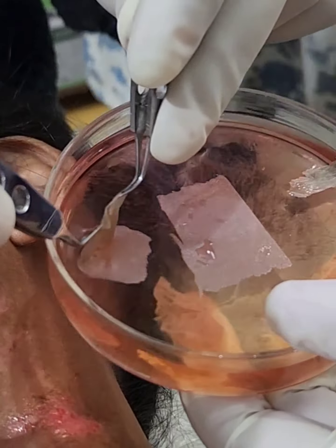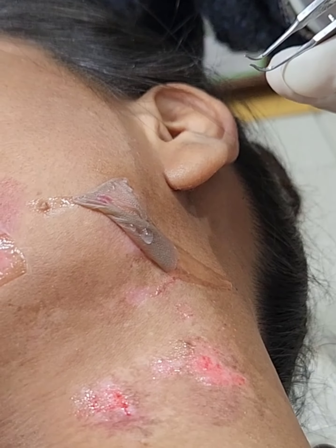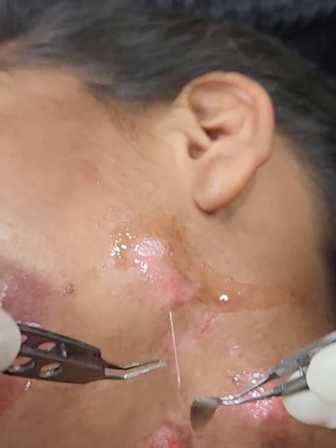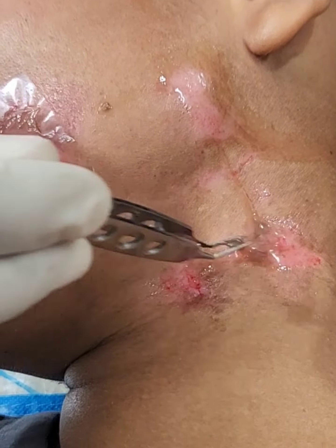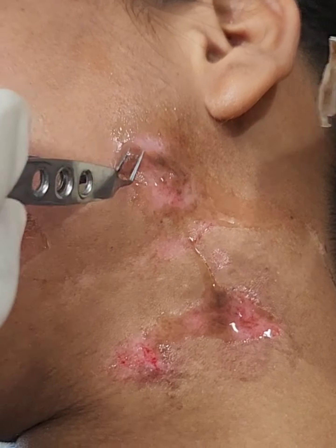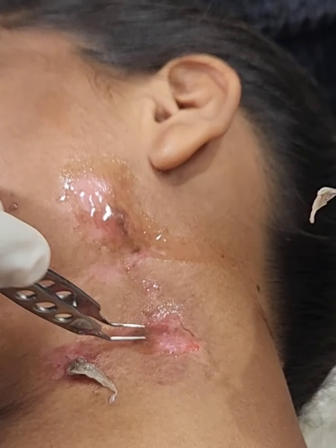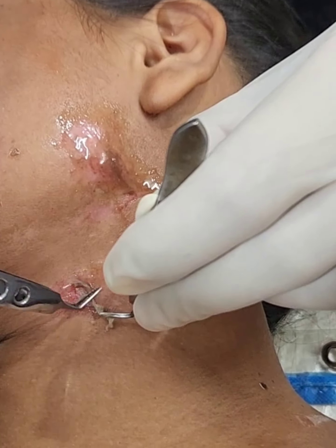Another very thin sheet is taken. The dermal fragment has been removed and the cells are then separated out onto the other areas. You see the brownish thick cell suspension — a very small fragment, a small part of the donor site, can cover large amounts of recipient area. No loss of melanocytes is seen because of centrifugation or any other mechanical trauma.